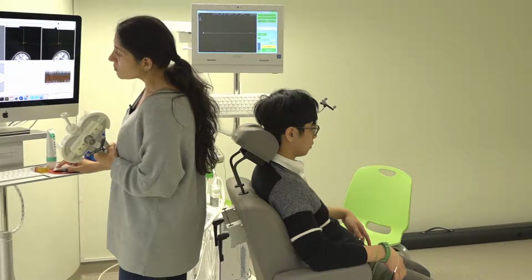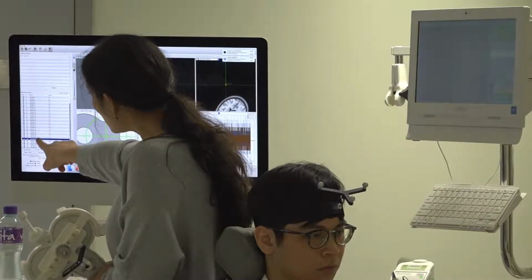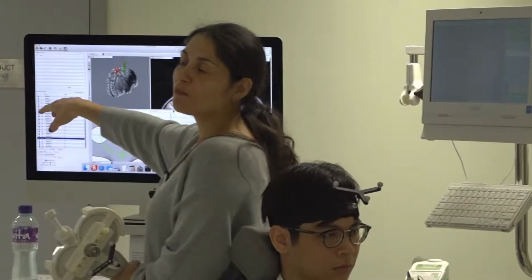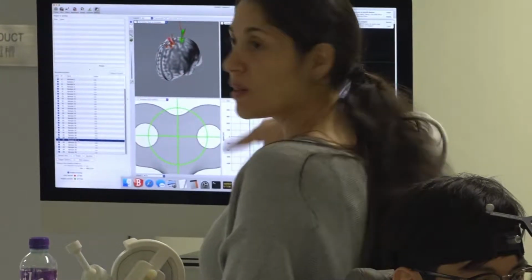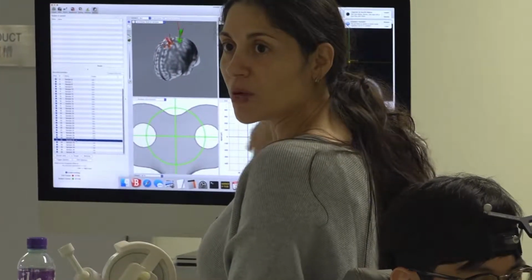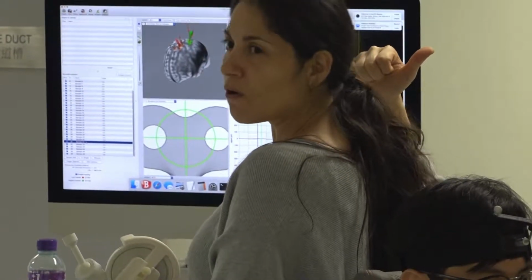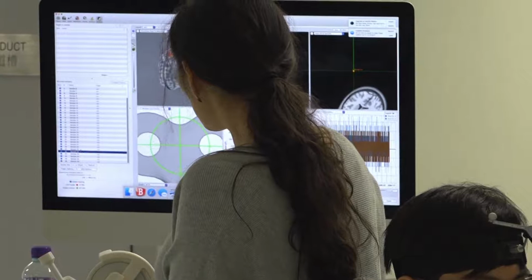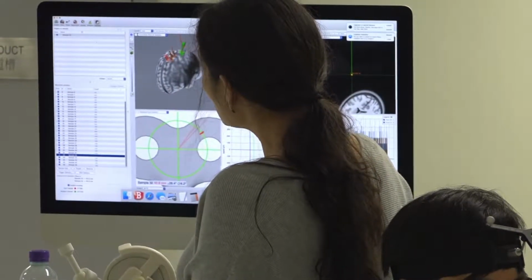As I don't have it, what I can do here is it has been sampling in the meantime. And I can select here, probably it was 3. When you use the equipment that comes with it, with the EMG, you will be able to see the MEP here, but we don't have it. So I'm trying to think, okay, it was like 3 before or 4 before. So this position should be it, and then I mark it here and say, go on, this is a target.